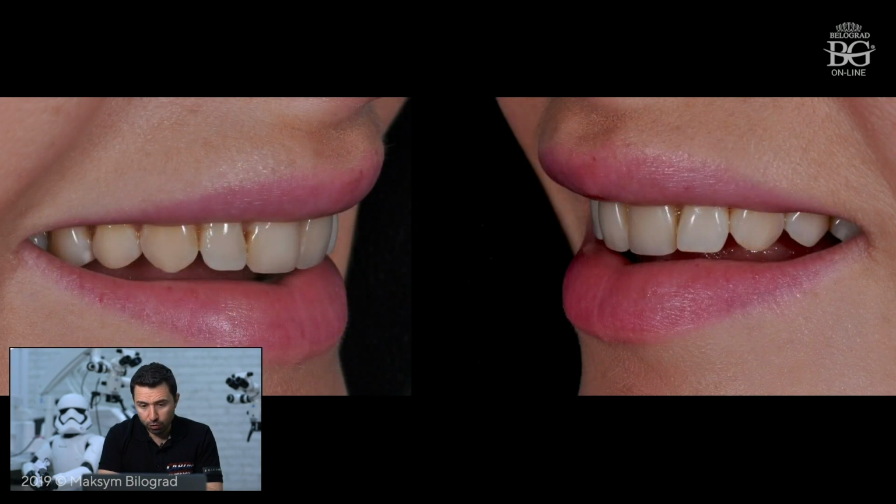Also, it's crucial to get and to evaluate pictures at 45 degrees or 90 degrees, which means profile pictures, because these pictures tell us a lot of useful information. For example, this patient, you can see, has retroclined frontal teeth. Okay, so they are retroclined.